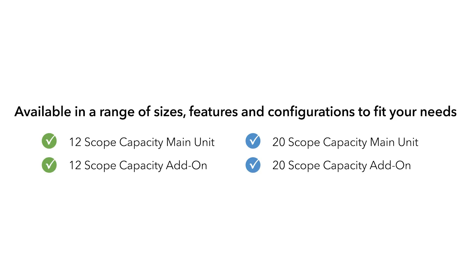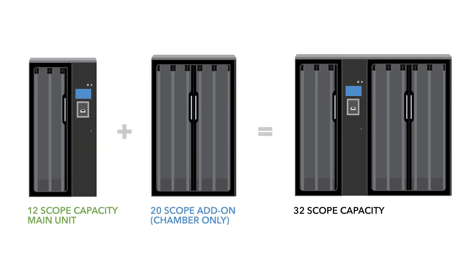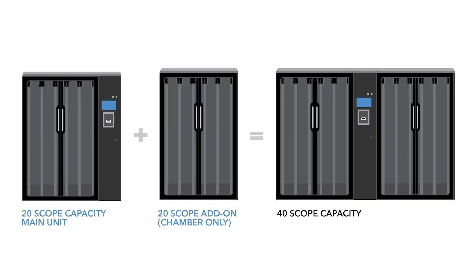Different configurations of the Reliance 6500 Cabinet are available, including 12 and 20 endoscope capacity main units, and 12 and 20 cabinet expansion modules to increase storage capacity up to a maximum of 40 endoscopes. In this in-service video, we will demonstrate with a 20 scope capacity main unit.